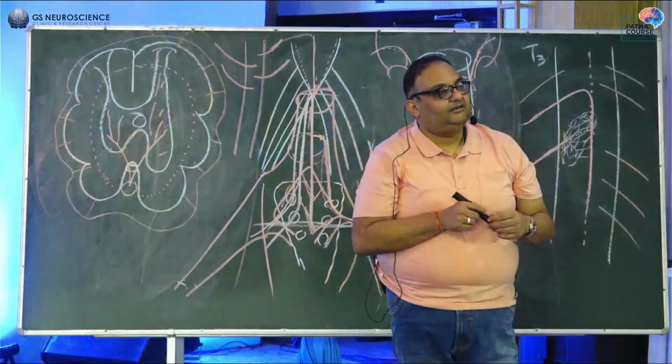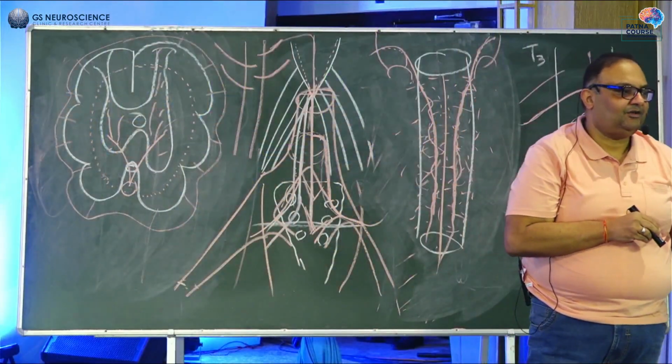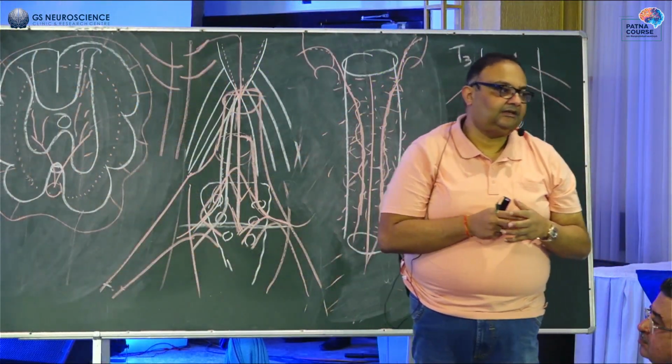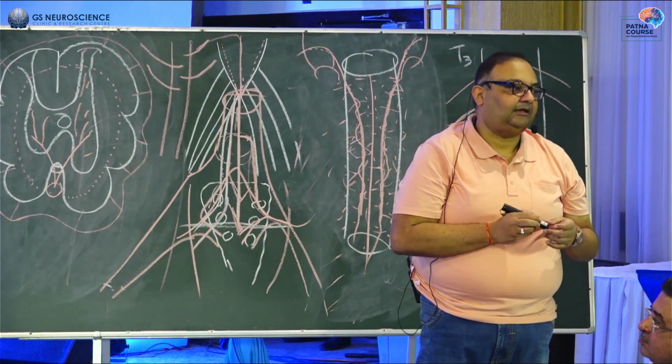That means you have not found the pedicle. You have to keep on searching. How many times? It happens. But we don't give up till we find it. In fact, now for localizing the fistula, we don't use DSA. We use first pass MR angiography. My MR technicians are so good that they do what we call a first pass MR angiography. The moment you inject gado, within 10 seconds of it, they do an ultra fast sequence. I will show you, we don't use DSA for localizing fistulas anymore. We do that on MR.